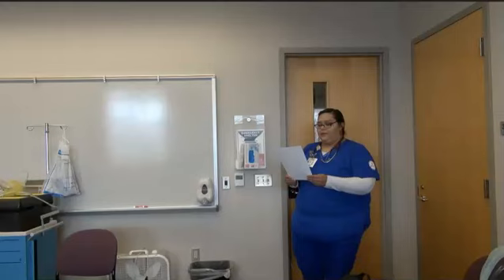Next, the respiratory therapist will obtain any necessary equipment, such as the small volume nebulizer, sterile saline, a stethoscope, and should they need it, any monitoring devices such as a pulse oximetry. Next, the therapist will obtain the medication and dosage as appropriately prescribed by the physician.